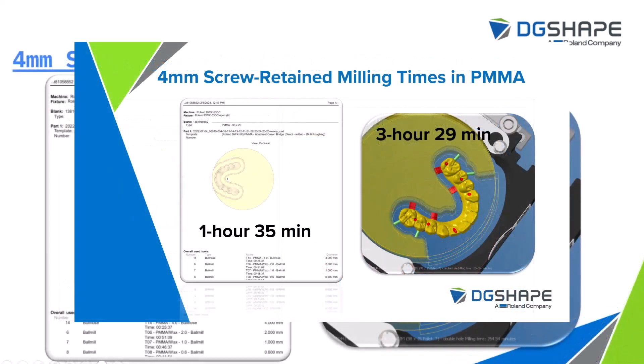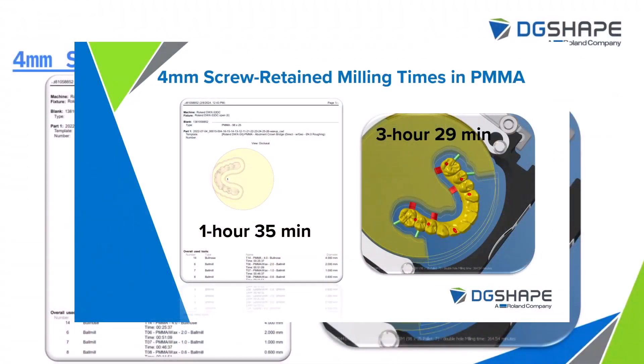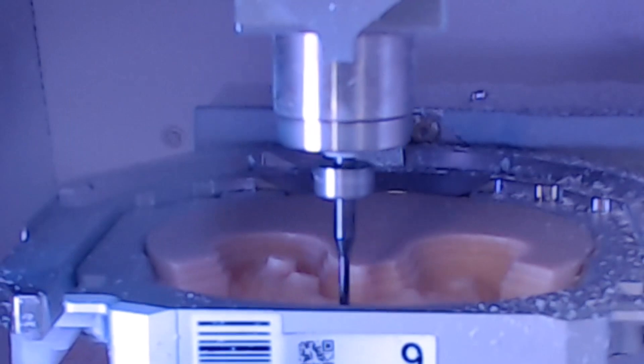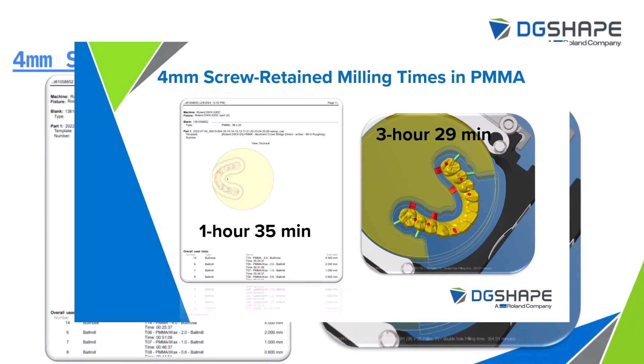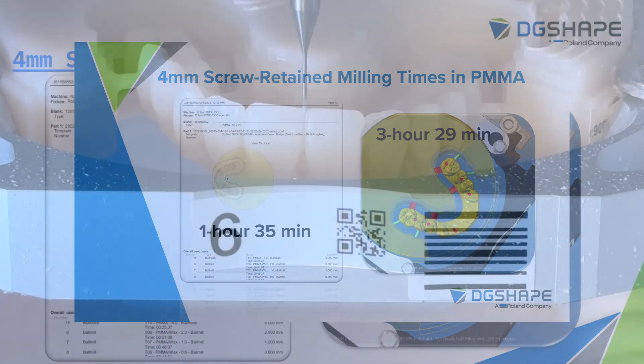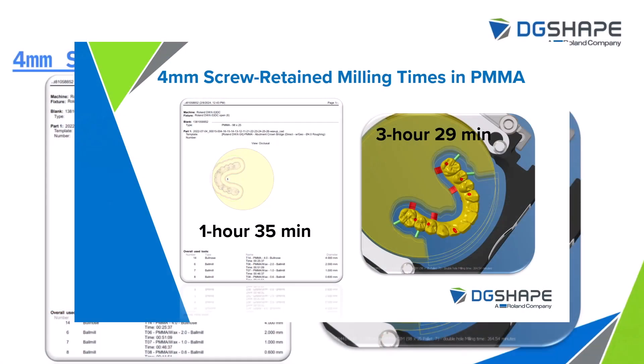Now let's talk about screw-retained full arch cases — whether for temporary try-ins or other uses, there are significant time savings here as well. On the left, a job calculated from HyperDent shows an all-on-four case in PMMA with six implant sites in a 25mm puck completed in just one hour and 35 minutes — incredibly fast compared to using just the 2mm tools for PMMA jobs. We're saving an hour and a half to two hours on cases like this. On the right, Millbox software shows milling times of just under three and a half hours for the very same case.